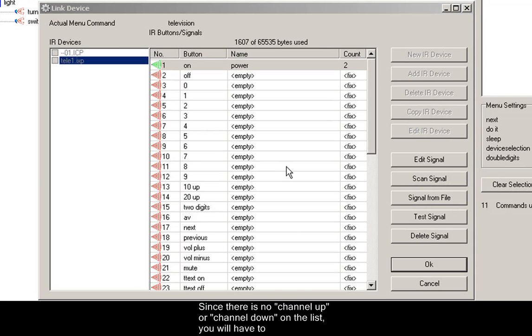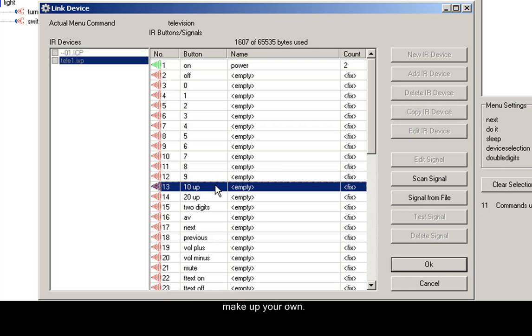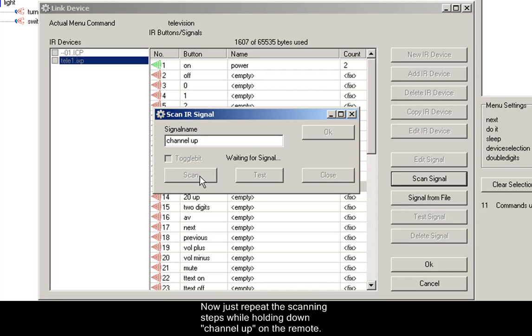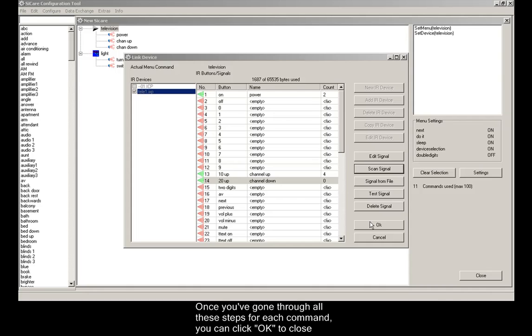Since there is no channel up or channel down on the list, you will have to make up your own. I have selected 10 up to substitute for channel up. You can change the name when you click the Scan button. Now just repeat the scanning steps while holding down channel up on the remote. Once you've gone through all these steps for each command, you can click OK to close the Link Device dialog box.